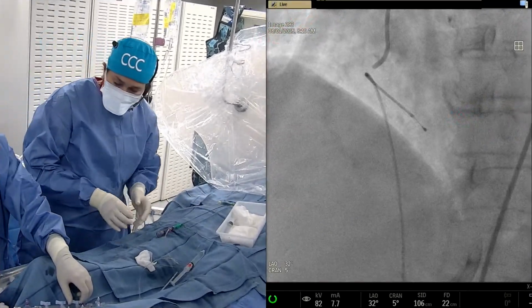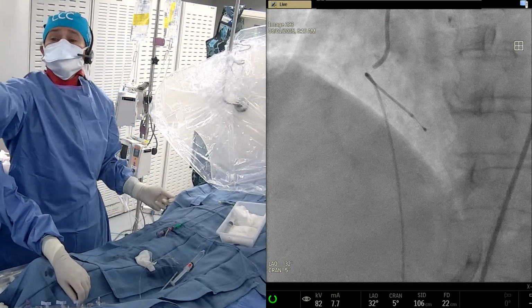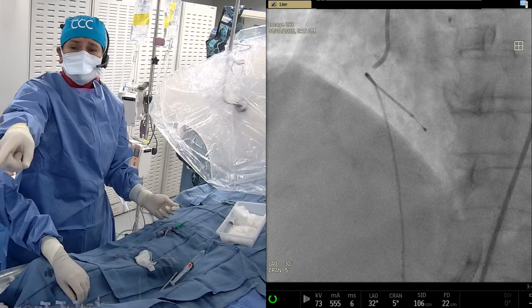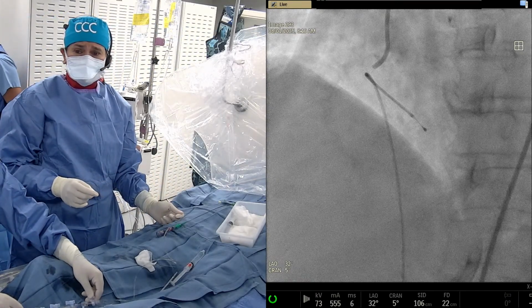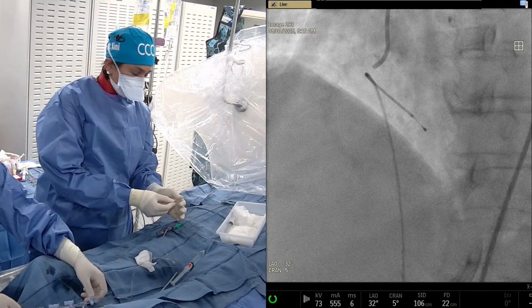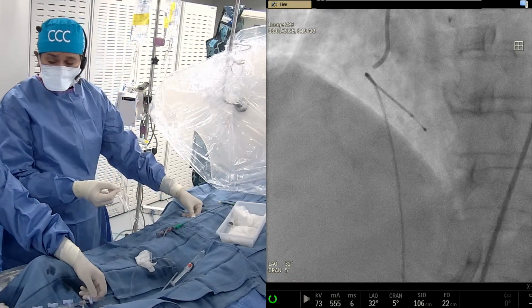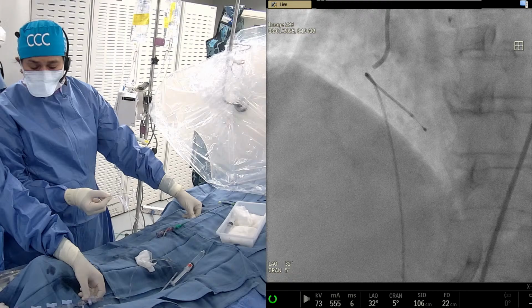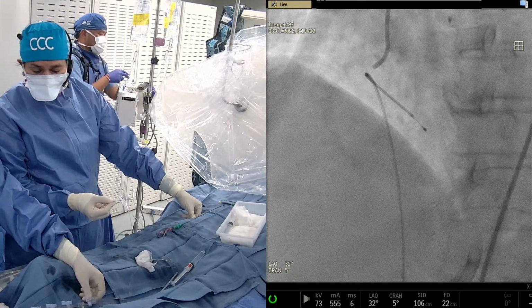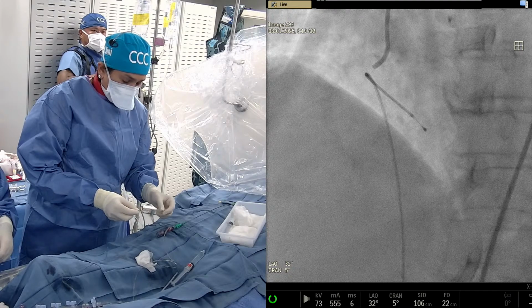Yeah. I know that some other centers use a lot of saline injection, but actually the contrast has much higher viscosity, like a better image. I saw some paper where with saline, sometimes it has a poor image, like a swirling because of the lower viscosity. And the multiple injections might cause some complication. That's why we use 100% contrast imaging. But I know more and more data is coming for the saline injection. So, and I think it's trying to, oh, go ahead.